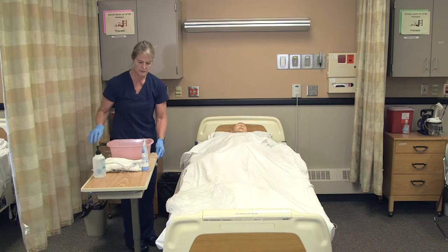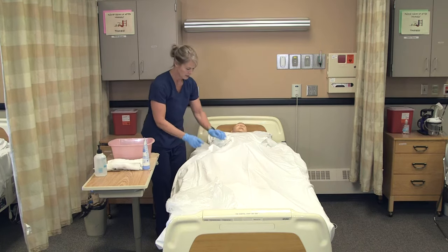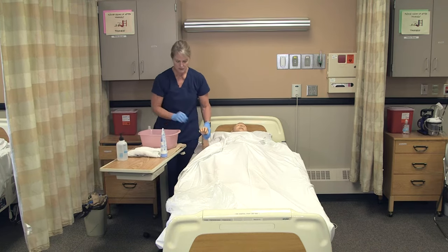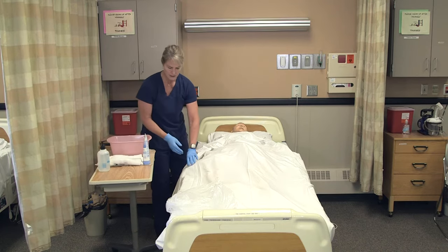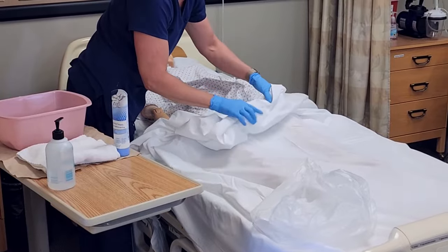I'll bring the tray table closer to me, put both washcloths in there, and again I'll have Lee check the water with his hand — or if he can't reach, he'll take the washcloth and put it on the back of his hand to make sure it's a good temperature for him. We're going to expose just the area we're going to clean, just the catheter area.